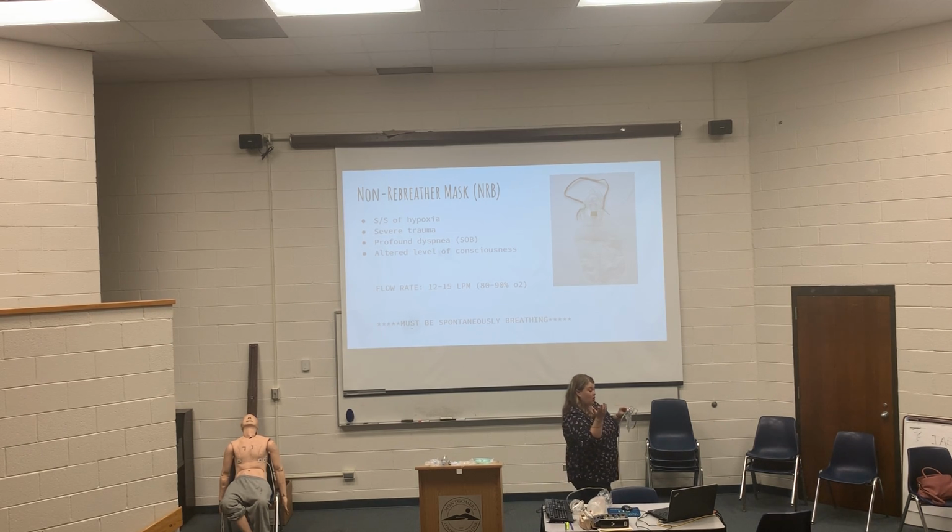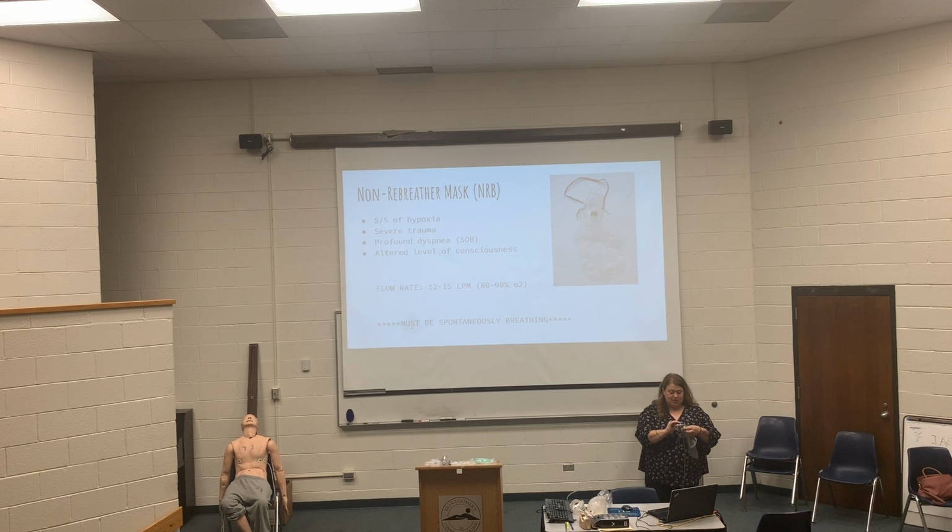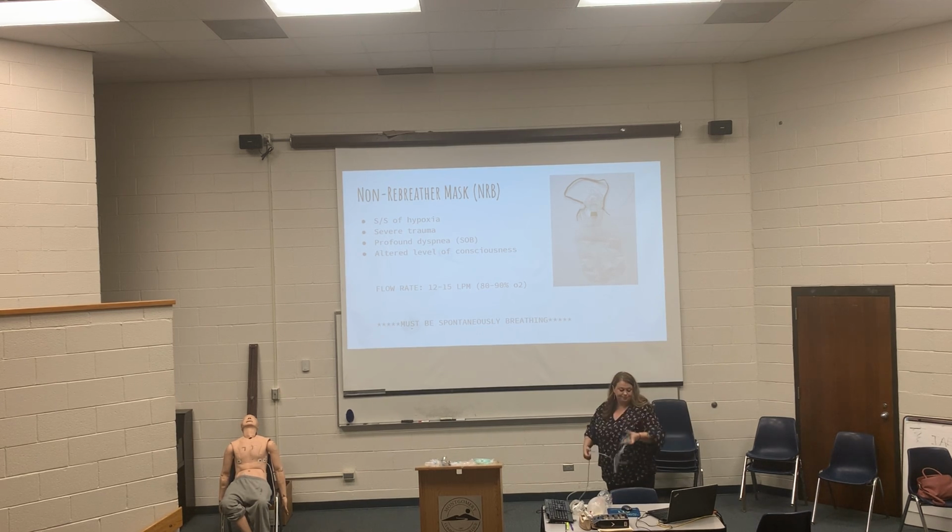The reason that they call it a non-rebreather is because they have these valves on there. So again, when they breathe out, that comes in, but when they're breathing in, they're not getting the atmospheric oxygen, they're getting just this. So that shuts down. So that's truly what those are for.